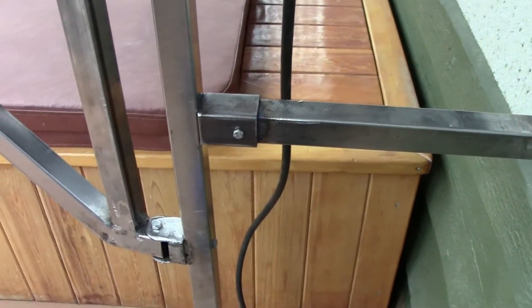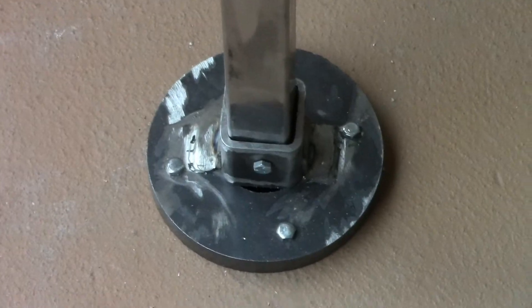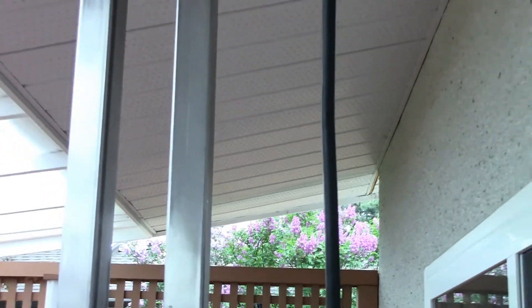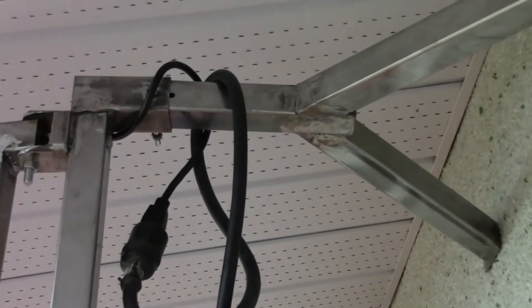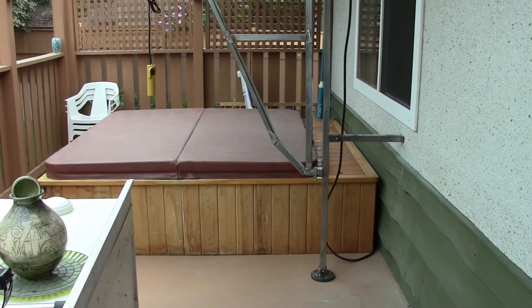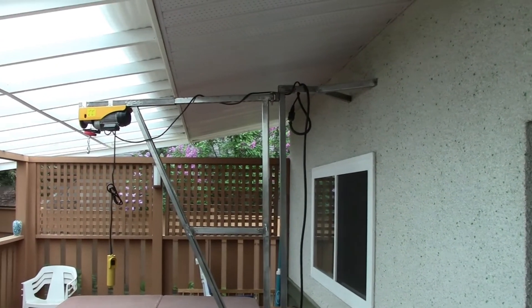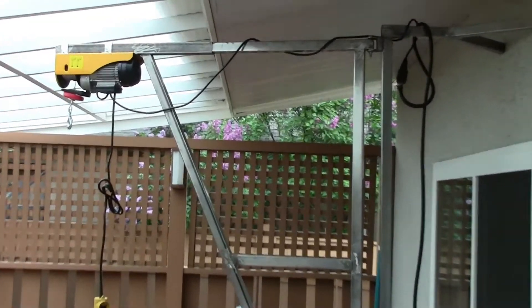Here we have the swing lift entirely built and installed. There's the collar going through the floor with the pin in it. There are the braces to the wall to keep it from swaying side to side, fastened right through the wall on ready rod through into the inside of the garage. The swing lift is fully installed with the winch on it — we'll try it out just before we take it all apart again and paint it.